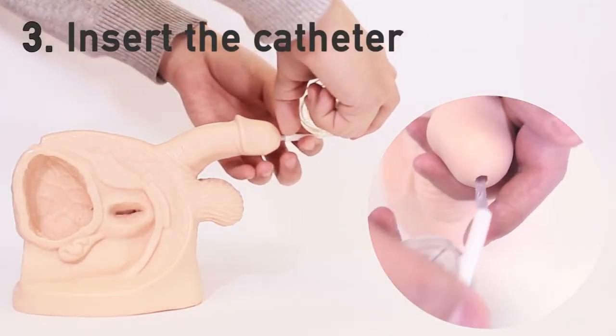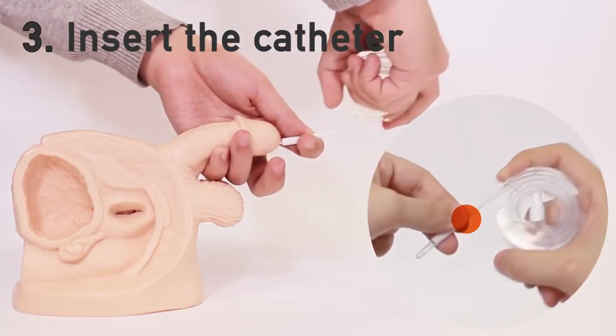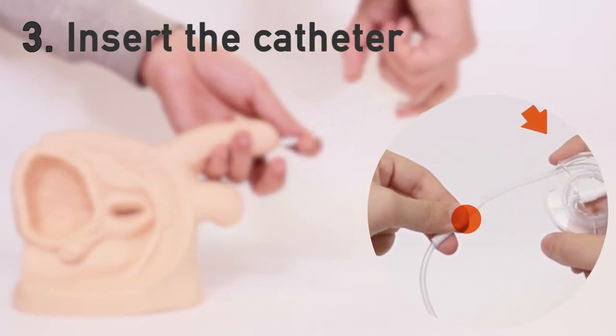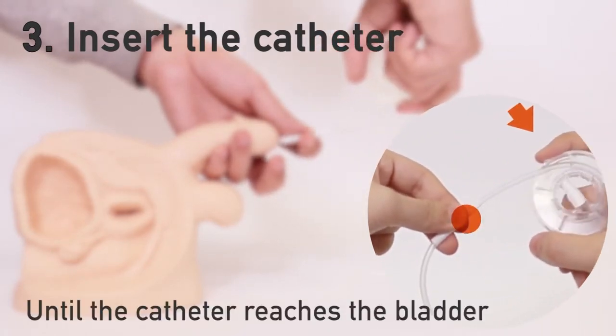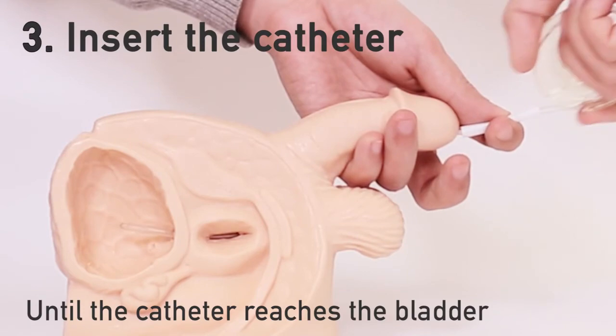Once the catheter tip is revealed, insert it into the urethra. Advance the catheter by pressing down on the handle while holding the sheath until the catheter reaches the bladder. Before the catheter reaches the bladder, you might feel some resistance.